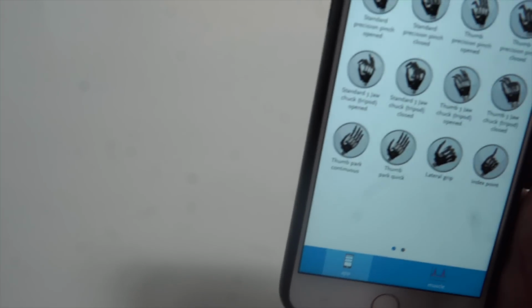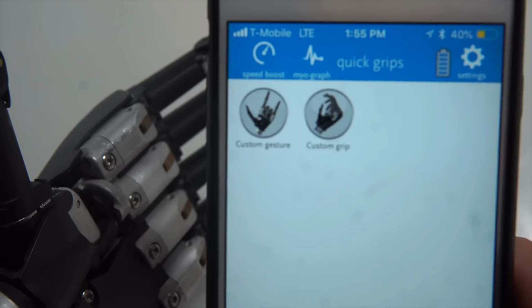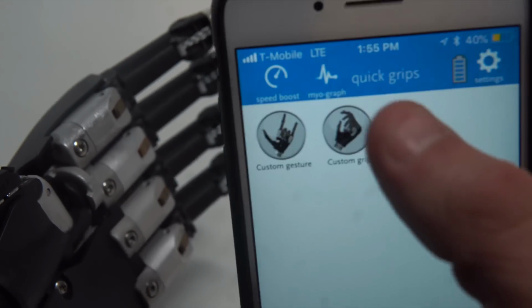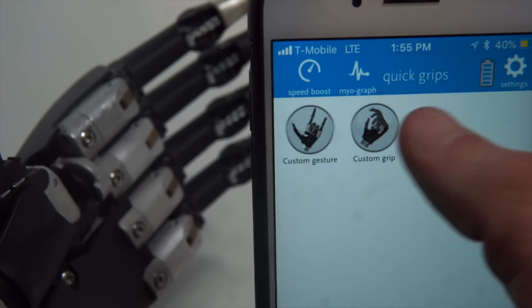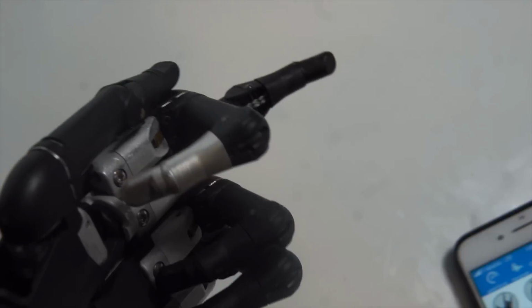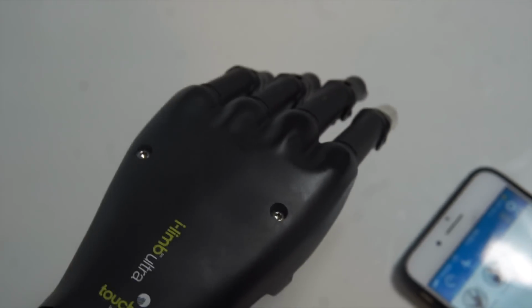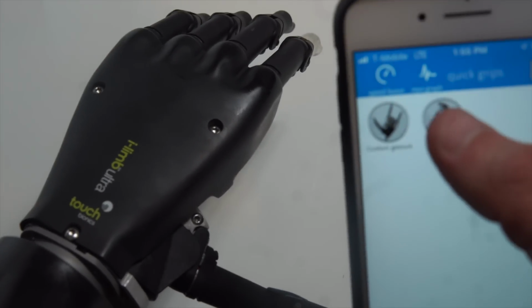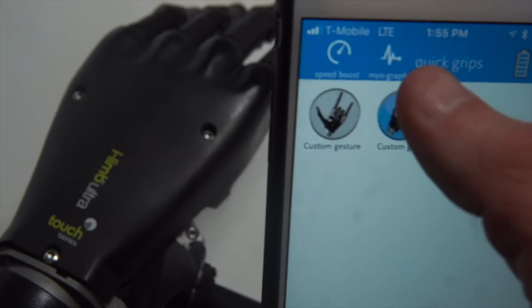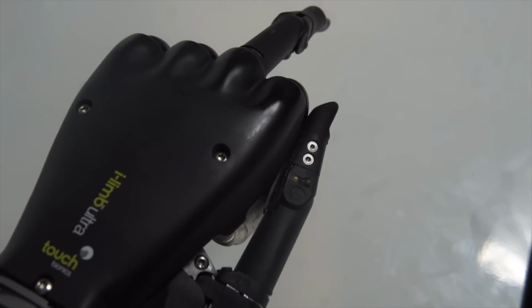But back to the different grips. We have the custom gesture grip here. You guys can see that. Different custom grips. That just went to the middle finger because that's the custom grip that I have it set on. Turn the hand around so you guys can see that. So when I press custom grip, that's what it does.